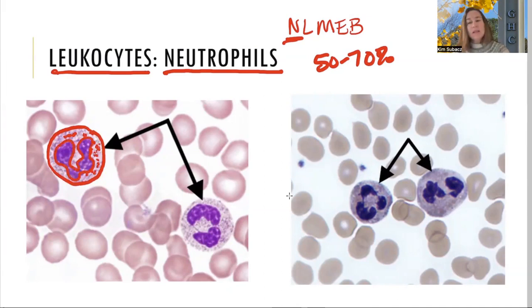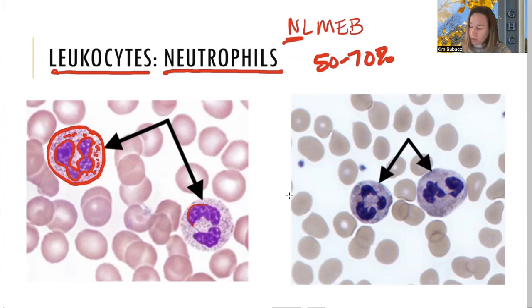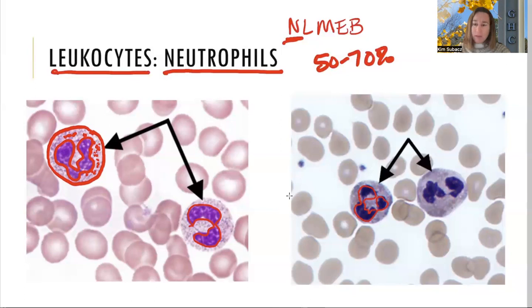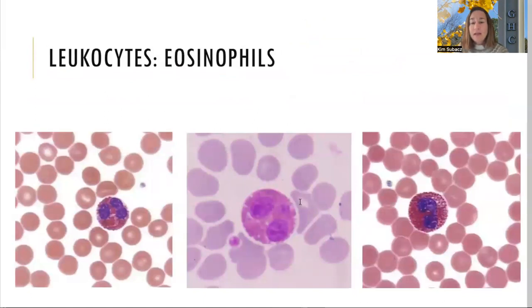The biggest giveaway for identifying neutrophils is their multi-lobed nucleus — if you see a cell with a multi-lobed nucleus, it is most likely a neutrophil. The multi-lobed nucleus looks like a necklace with beads on a string. To summarize: neutrophils are 50–70% of white blood cells, their job is phagocytic, and their identifier is that multi-lobed nucleus.